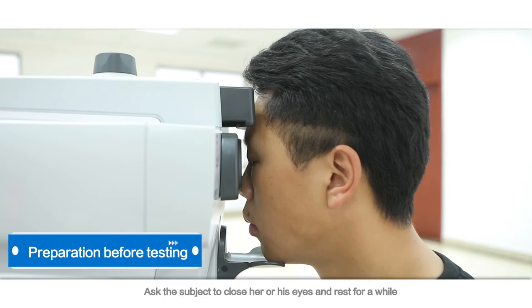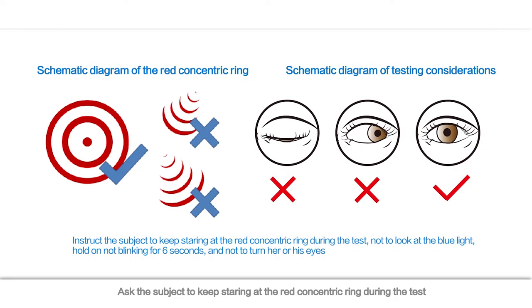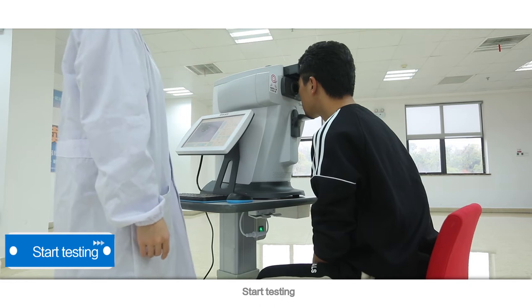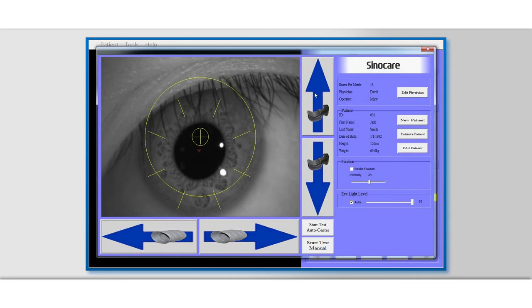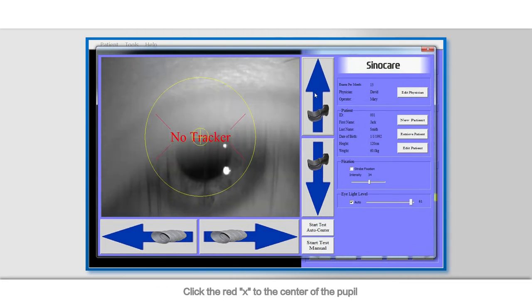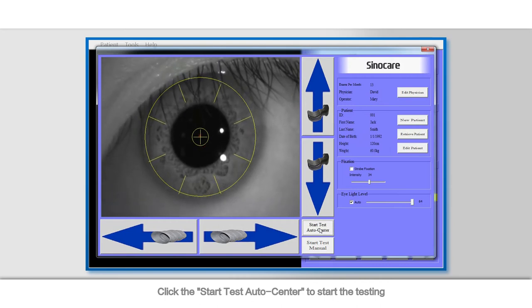Preparation before testing: ask the subject to close her or his eyes and rest for a while. Ask the subject to keep staring at the red concentric ring during the test — don't look at the blue light, hold on without blinking your eyes for 6 seconds, and don't turn your eyes. Start testing: tell the subject to open her or his eyes after the instruction. Click the red X to the center of the pupil, then click Start Test Auto Center to begin the testing.